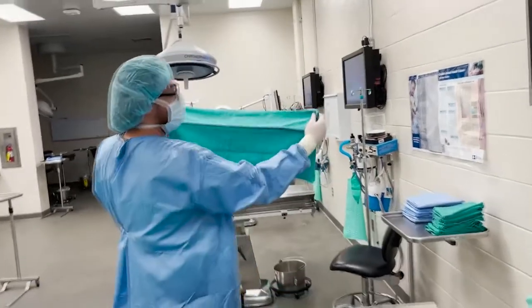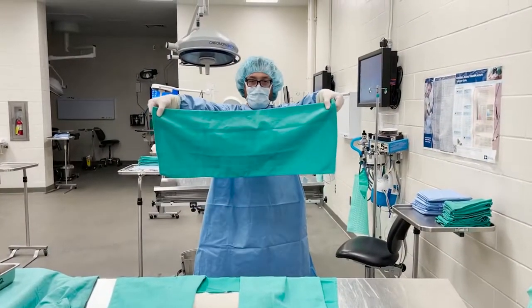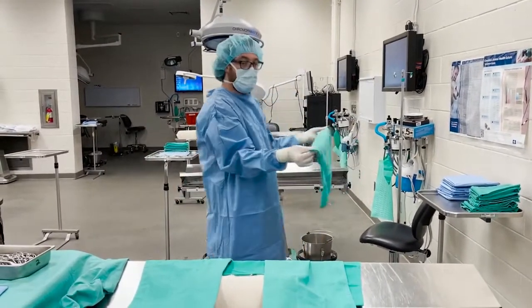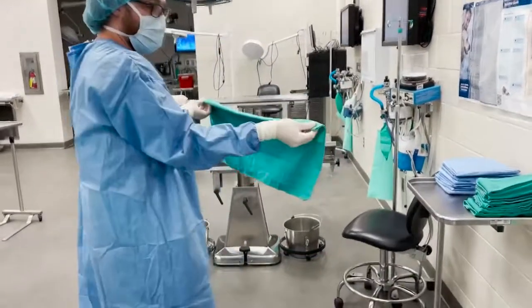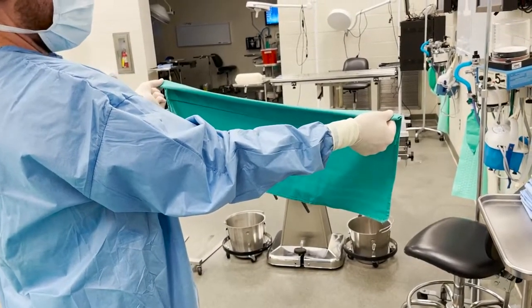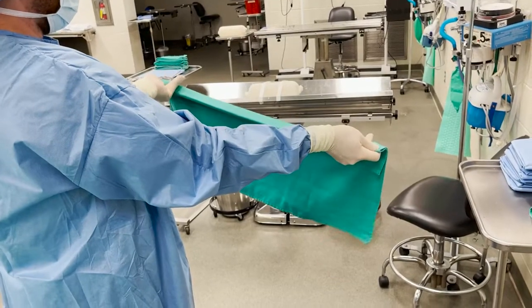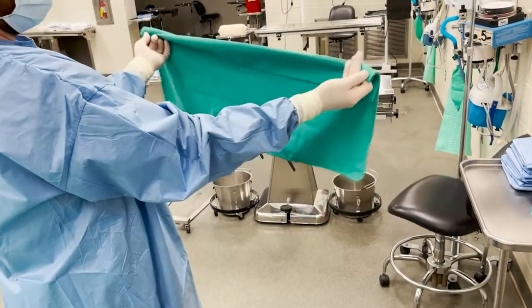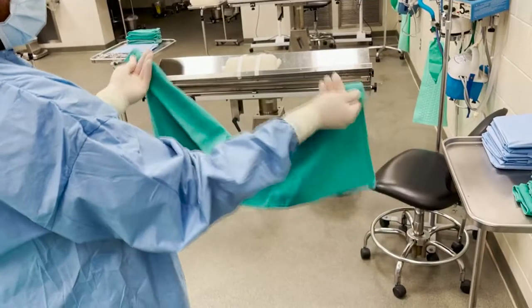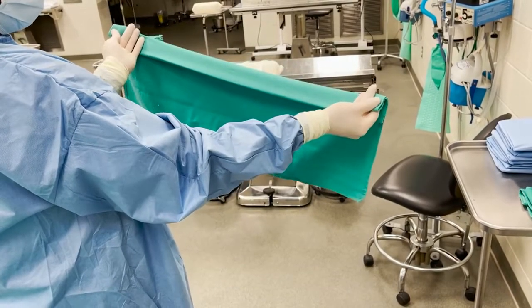Rather than the usual grip, your thumb and index finger are going to switch — thumb forward, index finger behind, with the other fingers still free. Pinch it so you have a little folded edge. Then with the rest of your fingers, make a fist and bring your hands and thumbs together to make a little hammock. Then straighten your fingers out over the top of that hammock. You need to have this folded enough and relaxed enough that you can get it over to the other side — not this side, but that side.